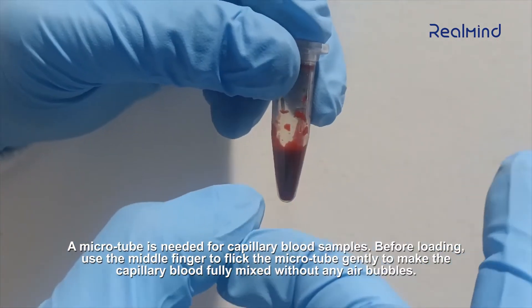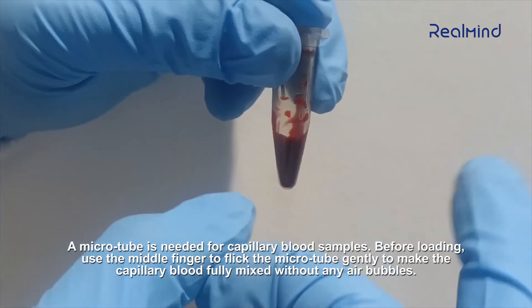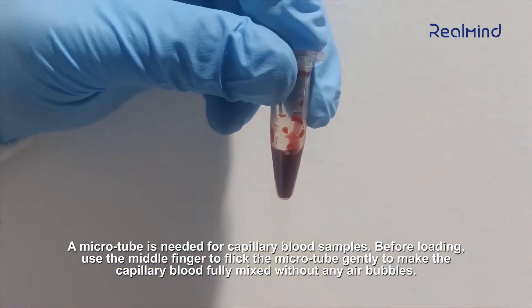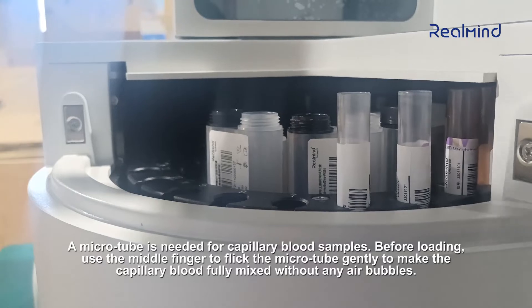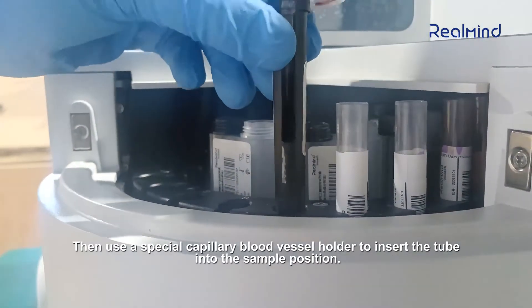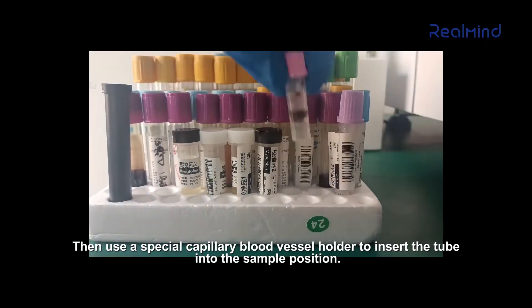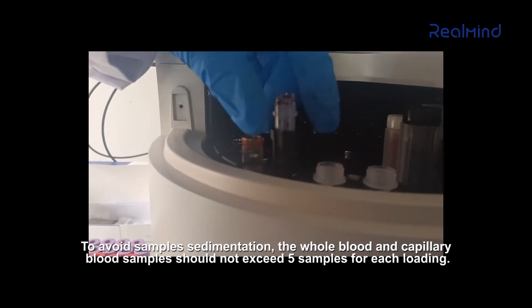Before loading capillary blood, use the middle finger to flick the microtube gently to make the capillary blood fully mixed without any air bubbles. Then use a special capillary blood vessel holder to insert the tube into the sample position. To avoid sample sedimentation, whole blood and capillary blood samples should not exceed five samples per loading.